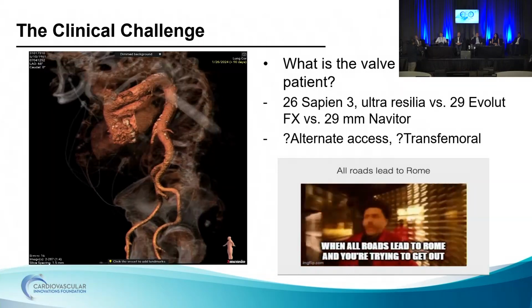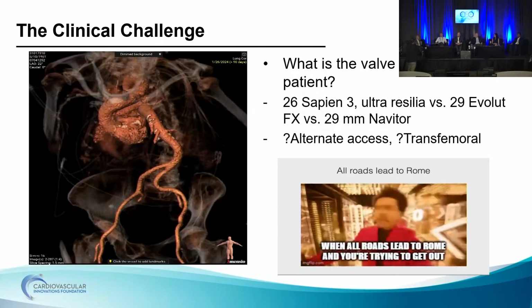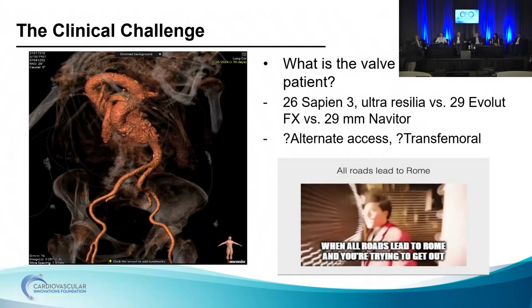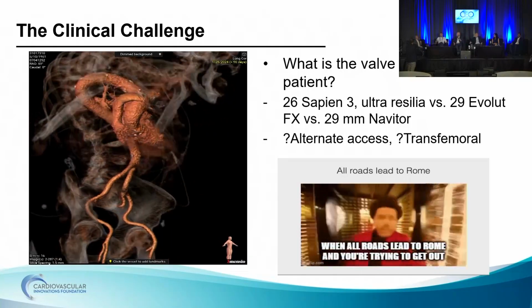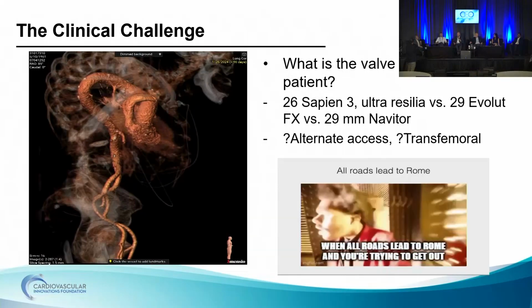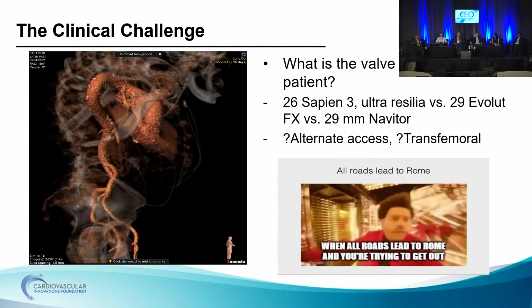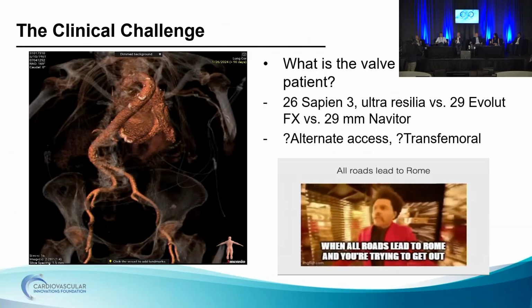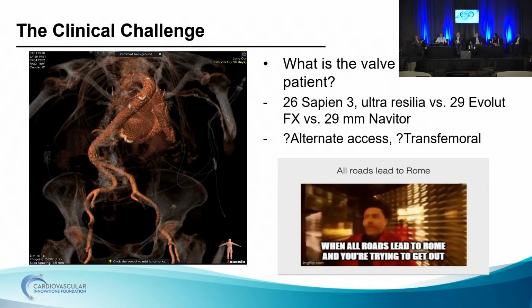Yep. And I've done that before. Or the valve of your choice. Yep. And it's actually worked quite well. And so, yeah, you have to be very careful with the mitral as you're coming out, but having a rail to deliver a retrograde TAVR, it actually works. It works pretty well as long as you're careful with the mitral.